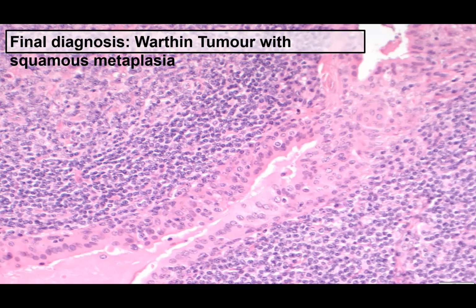So there wasn't an overinterpretation with this. This is a very difficult case because of the squamous metaplasia. And the problem with this was that the sample was not truly representative because there was not any sampling of oncocytes. But being aware that cystic lesions are difficult, they may not be representative, and being aware that metaplasias, particularly squamous, mucinous, and sebaceous, can occur in Warthin's tumor.